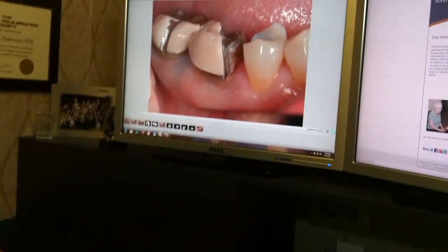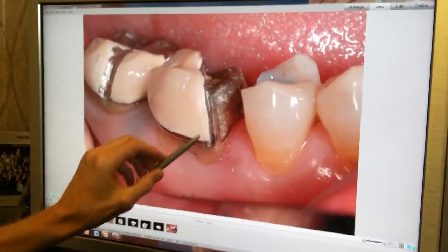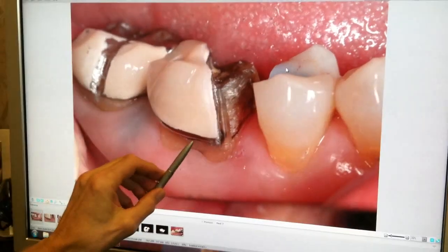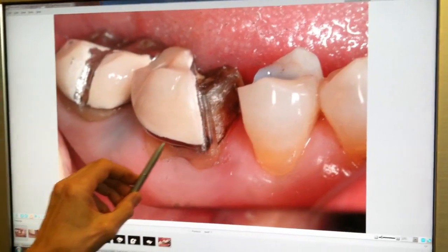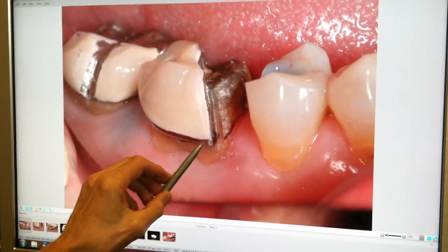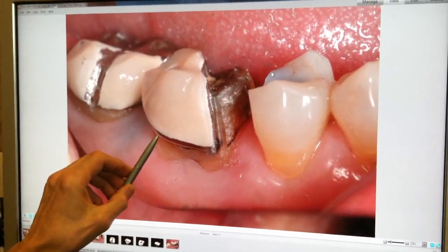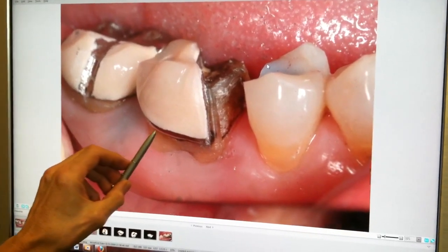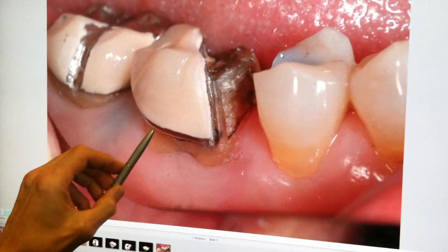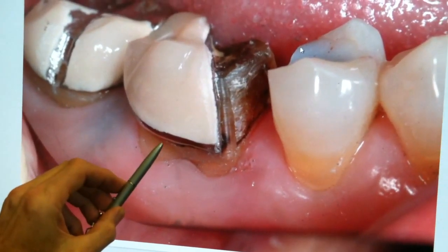So if you'll zero in on the computer screen, you can see that in this particular case I have cut the front half of this crown off, a crown that we were changing anyway because of crown margins and other issues, but the crown margin is right here on this edge where the crown stops and the tooth starts. And this crown's been on for many years, been very serviceable for many years. And if you look over here, it looks like there's no apparent gap or junction between these two, and I could run an instrument called an Explorer along here and it would seem good.